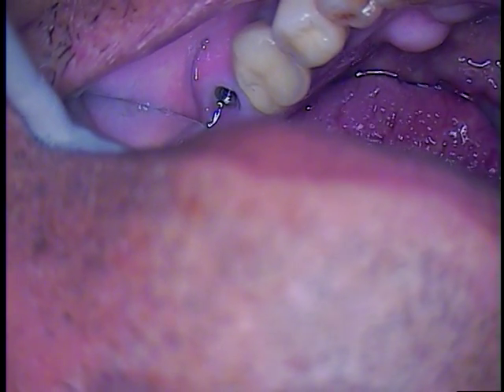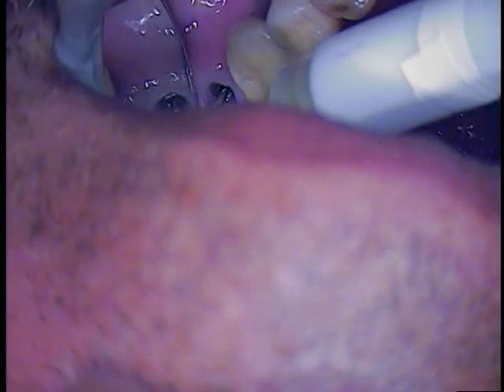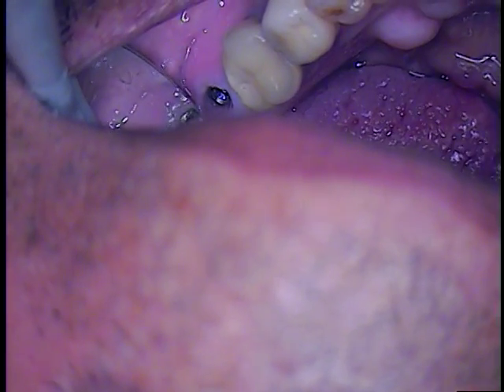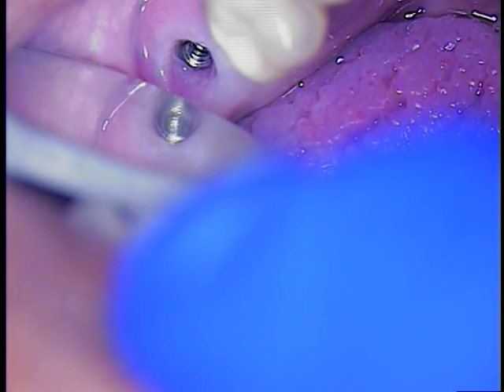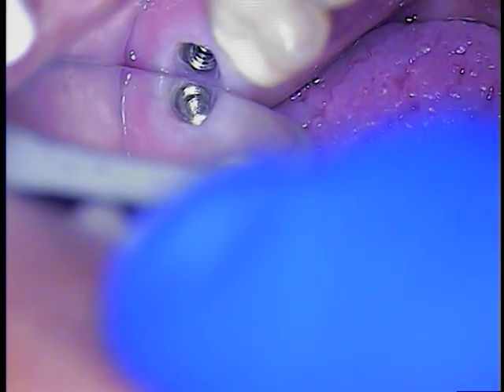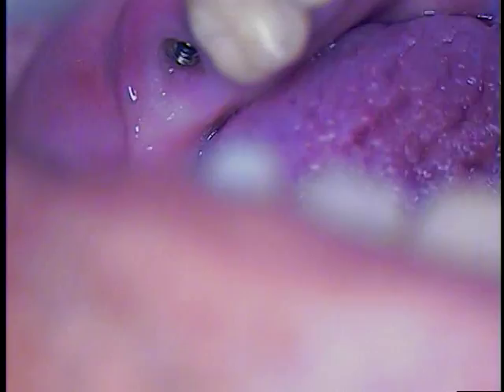The key is also on the instrument: mark one spot on that instrument to make sure. I'm looking at the threads themselves — we'll blow air on the mirror — and it's clear sailing all the way down. It's just those first threads, that's all it is. We're going to take another quick break; I'll be right back.